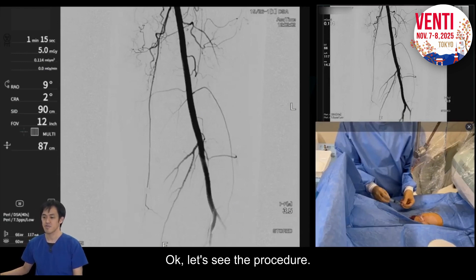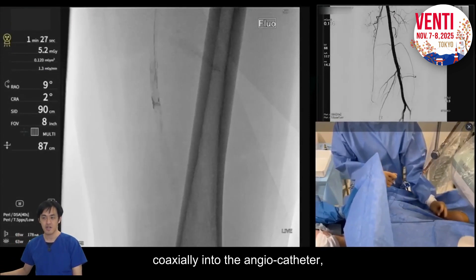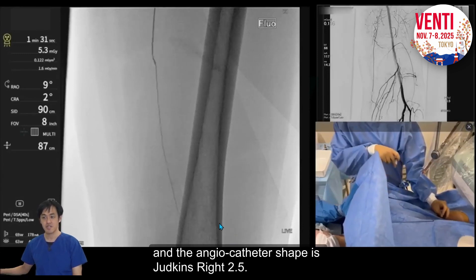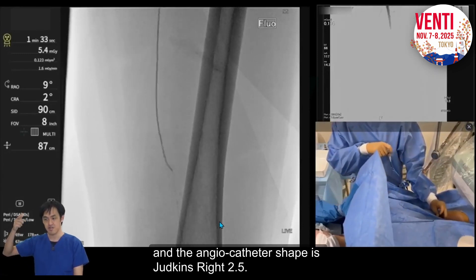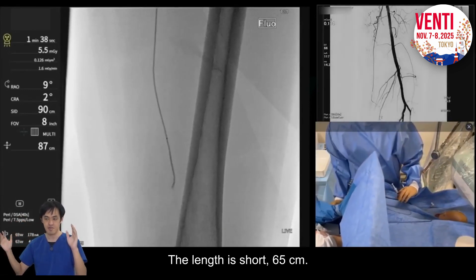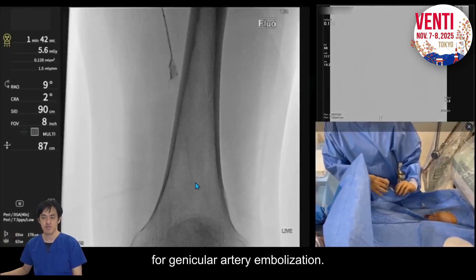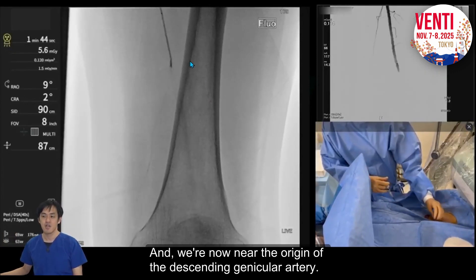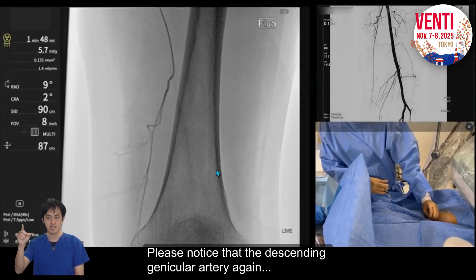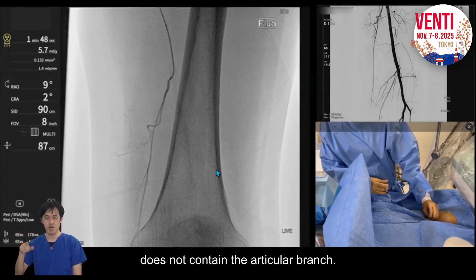Let's see the procedure. I started to insert the micro catheter coaxially into the angiocatheter. The angiocatheter shape is Judkins Right 2.5, length is short — 65 cm — designed for knee OA genicular artery embolization. We are now near the origin of the descending genicular artery. Notice again that the descending genicular artery does not contain the articular branch.